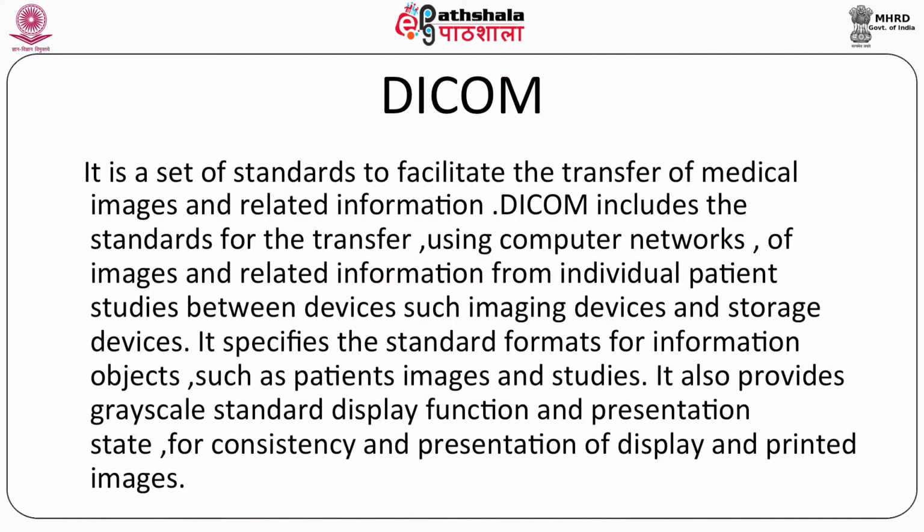Then DICOM is a set of standards to facilitate the transfer of medical images and related information. DICOM includes the standard for transfer, using a computer network, of images and related information from individual patient studies between devices such as imaging devices and storage devices. It also specifies the standard formats for information objects such as patient images and studies. It also provides a grayscale standard display function and presentation state for consistency of presentation of displayed and printed images.